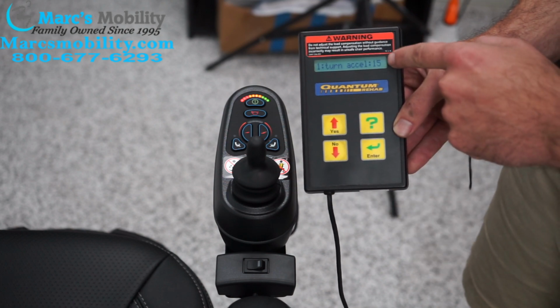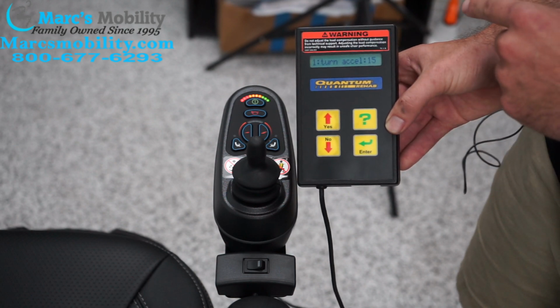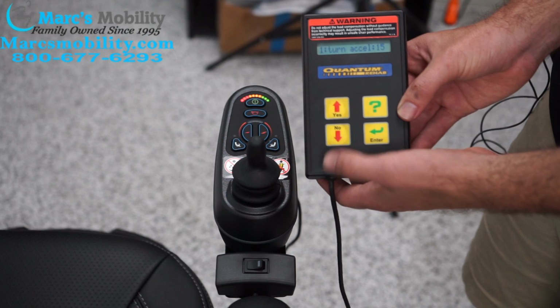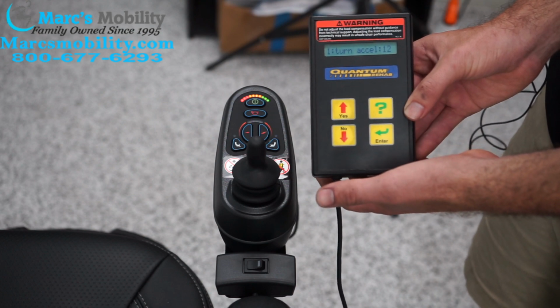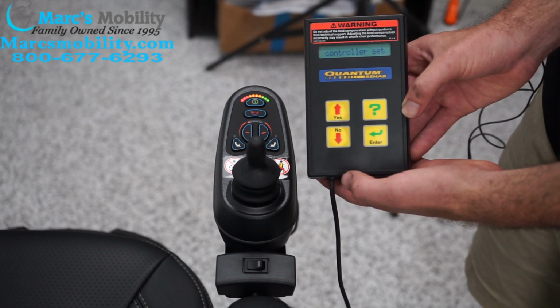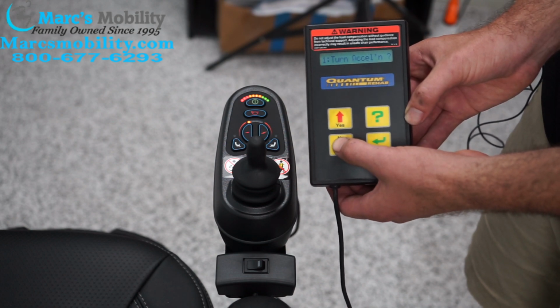So turn acceleration, it says it's at 15. It will give you a number between 1 and 100 in these settings. So 15 is pretty slow. If I do want to edit that, let's say I want it to be at 12. I will go down with the down arrow, set it to 12, and then I will hit enter. And it saves it. I'm going to keep going through.